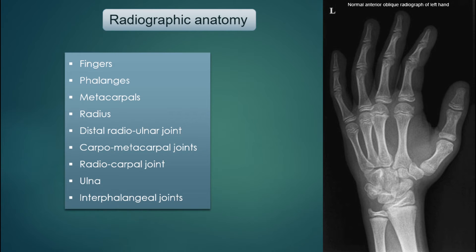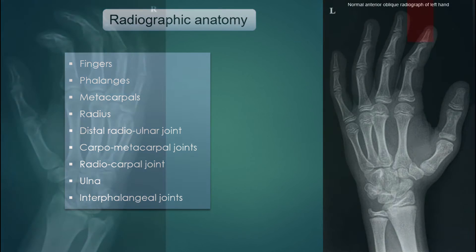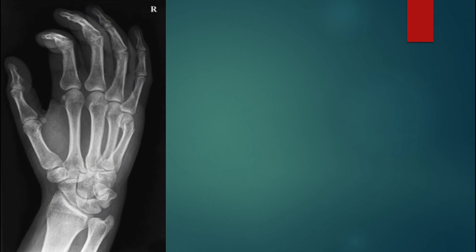Radiographic anatomy: fingers, phalanges, metacarpals, radius, distal radio-ulna joint, carpo-metacarpal joints, radiocarpal joint, ulna, and interphalangeal joint.